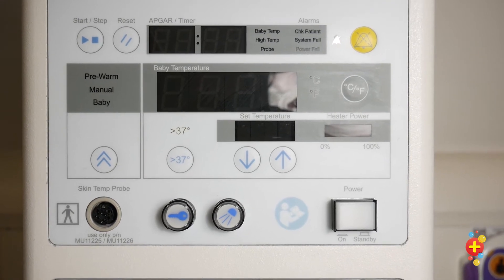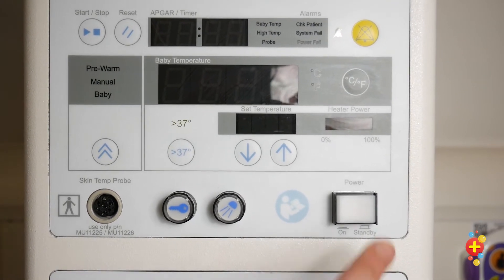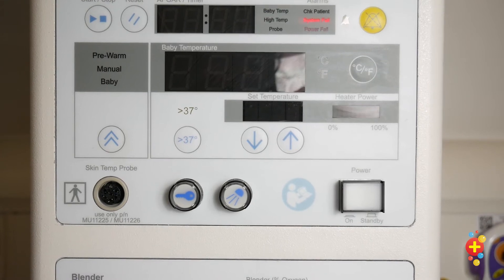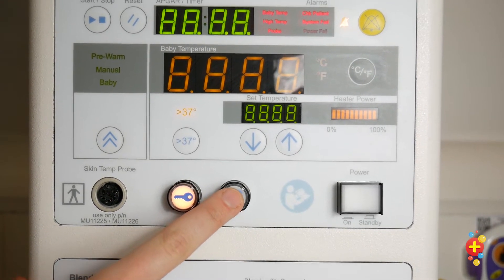Once the resuscitaire is plugged in and connected to the oxygen and air, we'll start by turning it on and then switching on the light so we can see what we're doing.